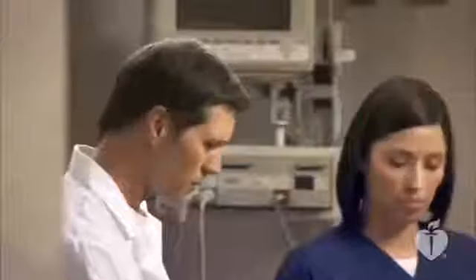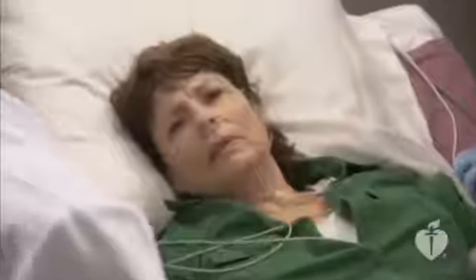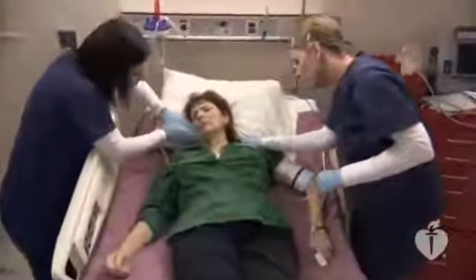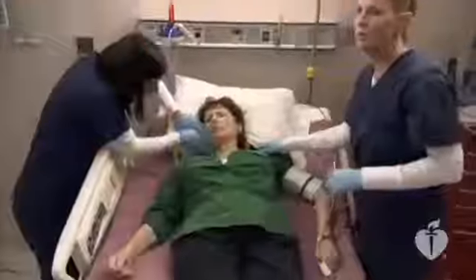Oh, doctor. I feel really dizzy. Okay, it looks like we have sinus bradycardia. Dana, let's go ahead and get an IV started right now. Miss Fernandez, Mrs. Fernandez, can you hear me? Mrs. Fernandez. She's unresponsive. I don't feel a pulse.